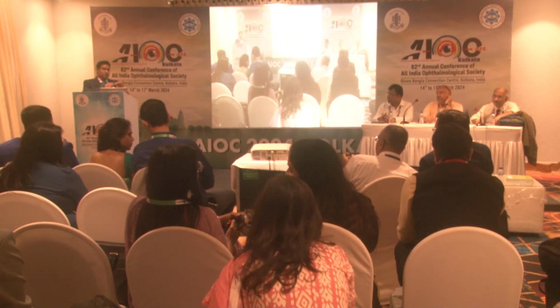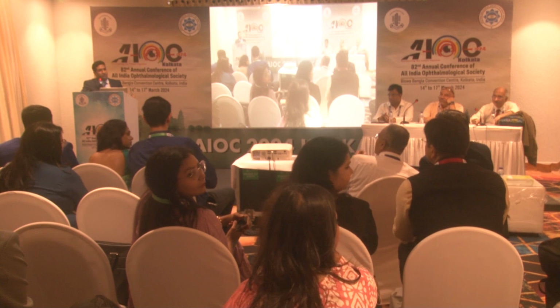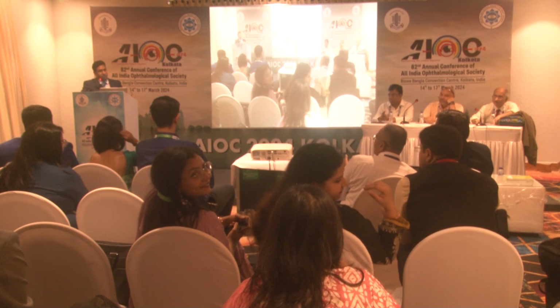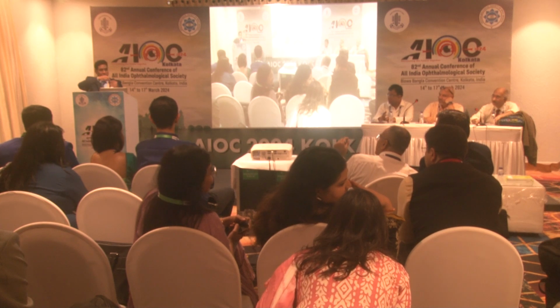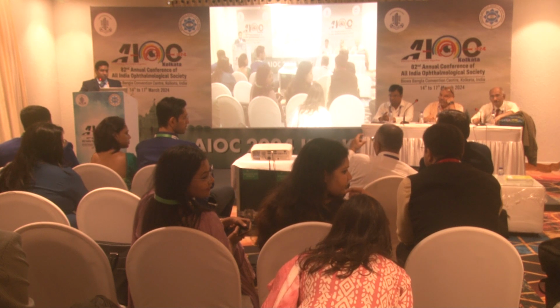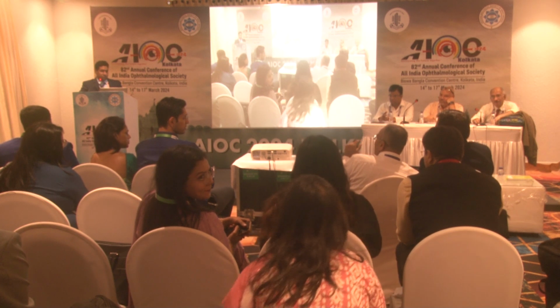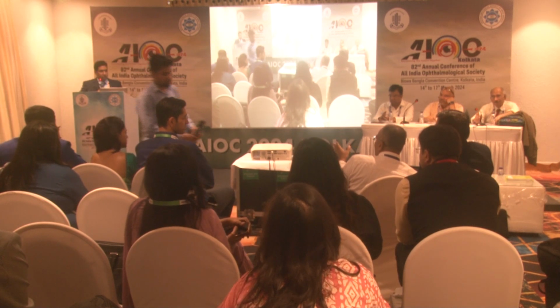But in the insulin syringe the needle is fixed, so I transfer it to another syringe, removing the plunger. The size of the bevel is exactly 1 millimeter, so whenever you make a guard, it has to be just behind the bevel, so that it goes into the suprachoroidal space.